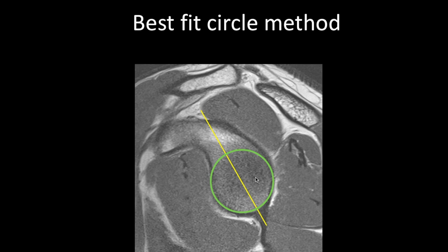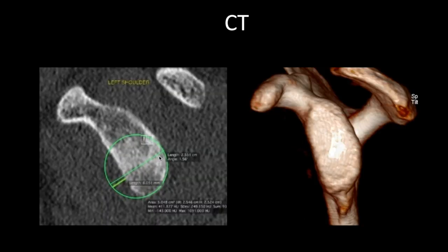Draw a longitudinal line along the axis of the glenoid, then draw a circle which best fits the posterior inferior and inferior margin of the glenoid. The anterior and posterior diameters of this circle should be the same size. If there is bone loss, we can calculate the percentage: the bone loss divided by the actual expected glenoid diameter, multiplied by 100, gives the percentage of bone loss. A 3D CT is considered the best method to measure bone loss, and since images of both shoulders are obtained, you can compare both sides.